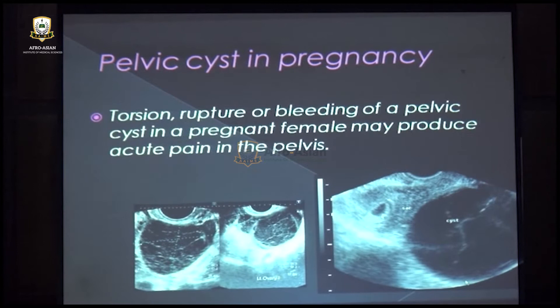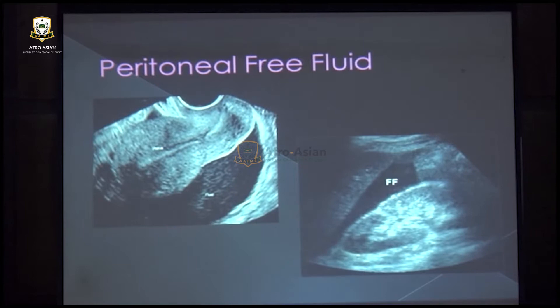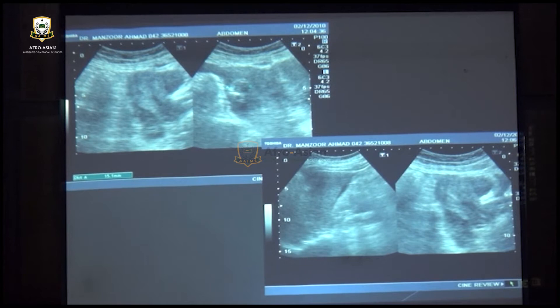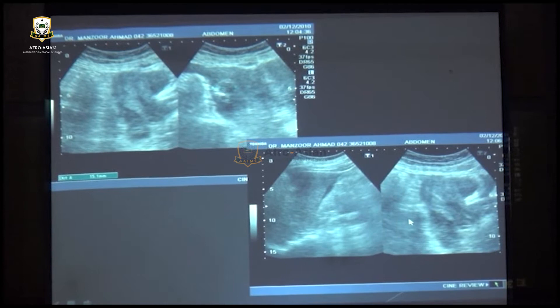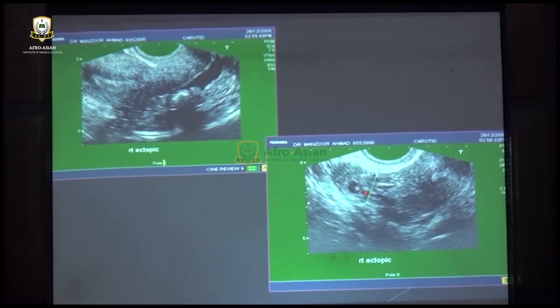Whenever a pregnant patient presents with pain, we must assess whether the pregnancy is normal and check for abnormal adnexal findings. Most of the time there is free fluid in the pelvis as well as in the abdominal space. The first thing to consider is ectopic pregnancy, which can be seen on both transabdominal and endovaginal scan. We can see the uterus, free fluid in the abdominal space, fluid in the cul-de-sac, and a thick-walled cystic area in the adnexal region confirming ectopic pregnancy.